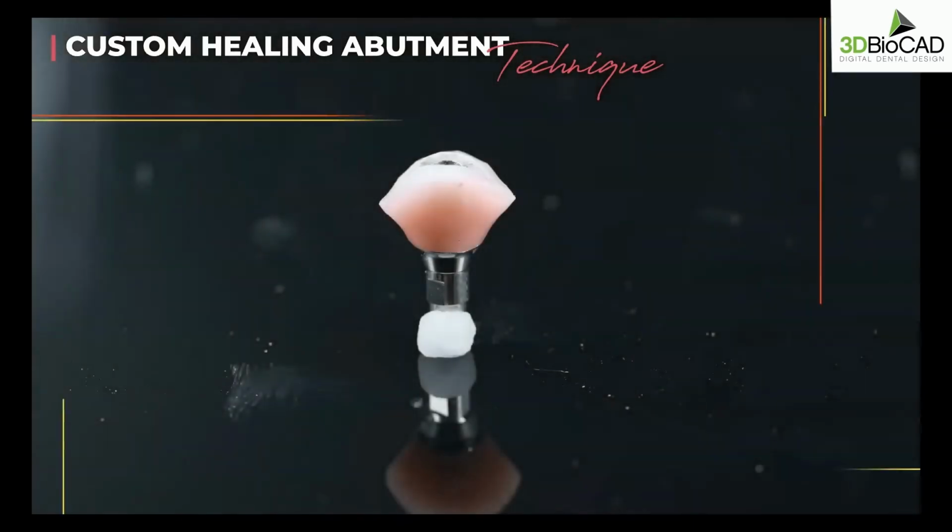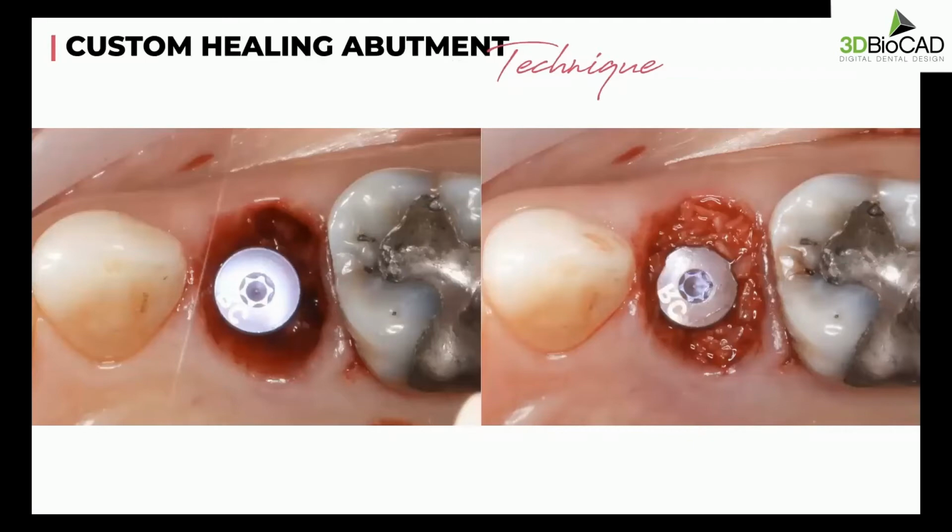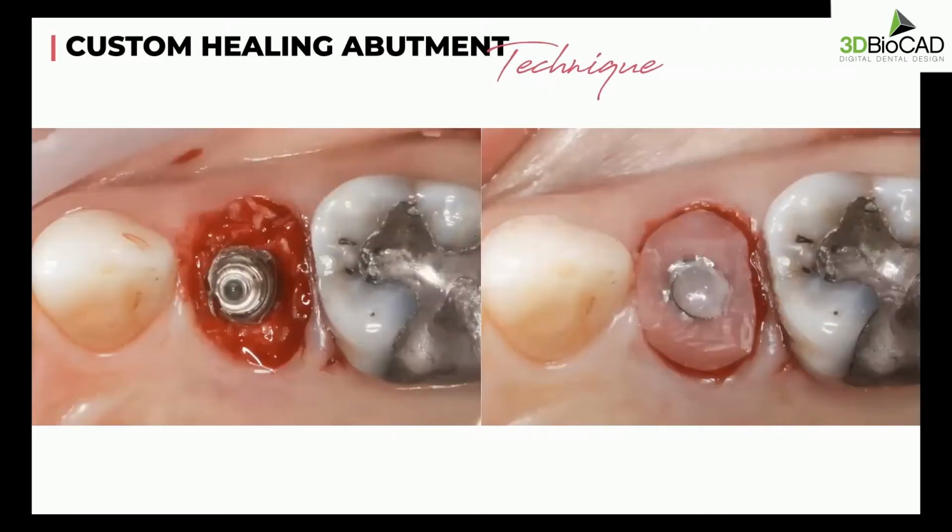Okay, this is how it looks outside the mouth. Now that the custom healing abutment is ready, we're ready to do the bone grafting. What we do is put a narrow diameter healing abutment, and then we pack the bone around the implant. Then very, very carefully, we remove the healing abutment from the implant, and we very carefully place the custom healing abutment into the mouth, onto the implant. If you look at the picture on the right, that's right after the surgery.